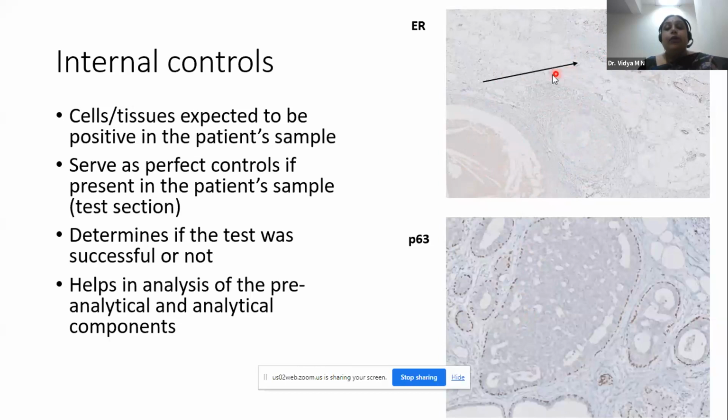Now it still will not matter whether the external positive control which I've taken in my slide is positive or not. I really need to see whether this ER has taken up the staining or not. Why is it?